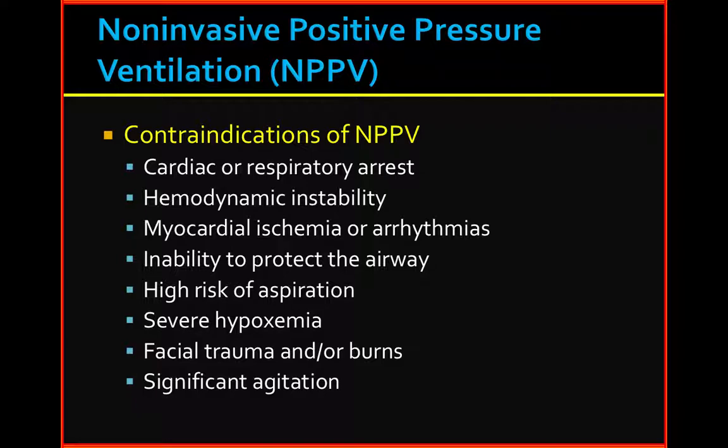It all comes down to two things: volume and pressure. Remember, nothing else, volume and pressure. And volume is generally about 8 mLs per kilogram. If the compliance of the lung goes down, then typically you'll have higher pressures. If the compliance of the lung is very high, in other words, a very compliant lung, then your pressures are going to tend to be on the lower side. Now, let's make this converse to pressure control. In pressure control, what we're doing is we're setting a pressure.